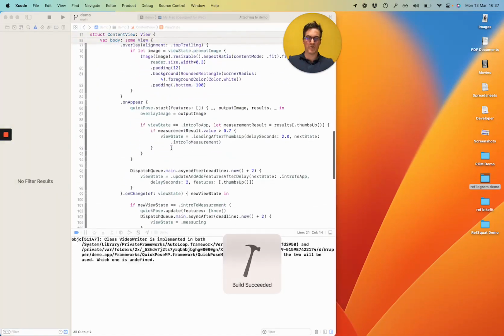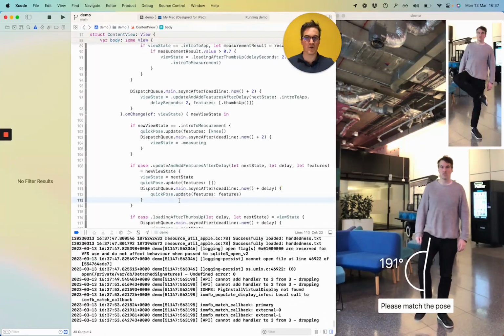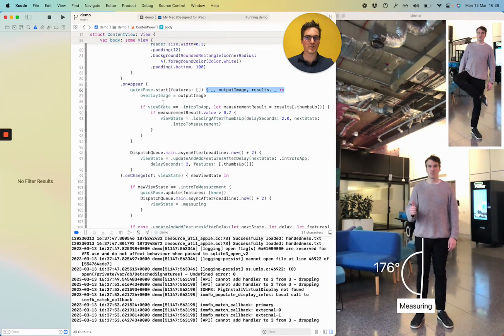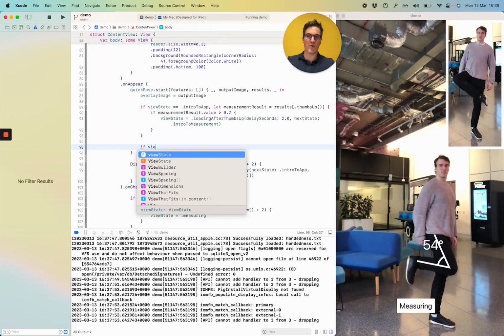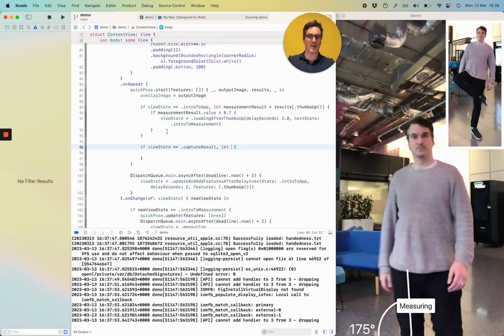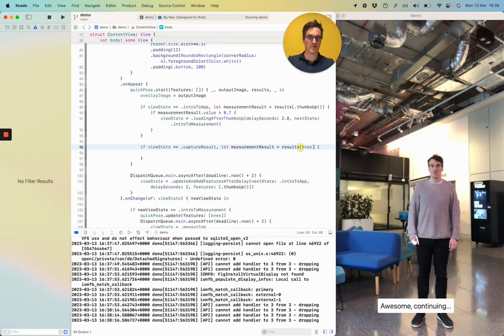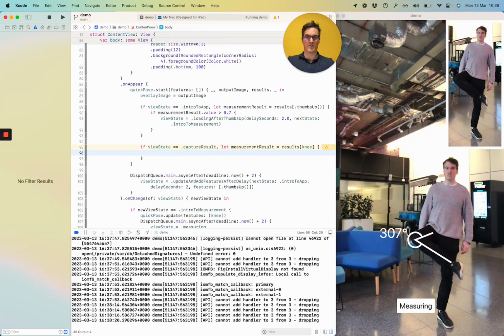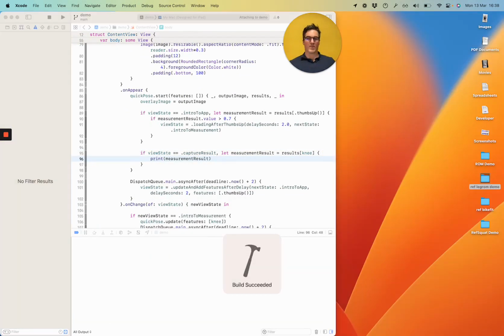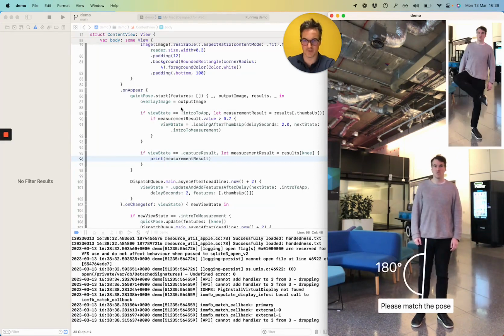So capture result, we want it to store the value somewhere, really. So when our QuickPose returns with our values, we want in here to say when my state is capture result, and then I want there to be a check as well for the actual feature. So is there a result returned, which is for the knee? Then I want to store that result. So for now, I'll just print the measurement result and see what we get. This is the first step towards moving the UI on, but it's always good to see the results coming out first before worrying too much about the UI.